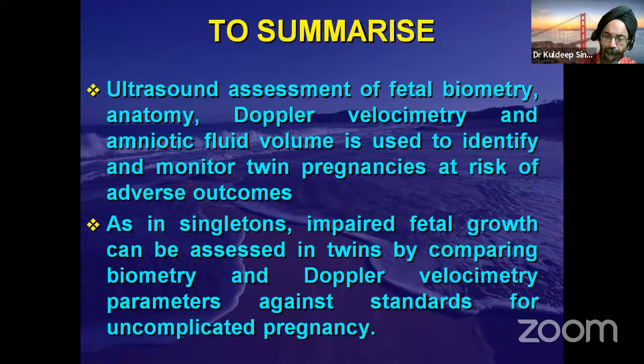So be very careful. Each and every scan that you're going to do is going to give you loads of information. Be very careful in seeing those findings. If somebody else has done it, please go through the pictures. Might be they're not mentioning something which you could be catching. And if you're doing it on your own, you've seen what all are the things you need to be looking for. So do that so that we can stretch the pregnancy as far as possible and make sure that both the babies, if it's a twin pregnancy, are given to the parents and both of them are hale and hearty.